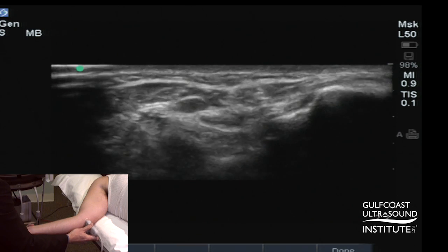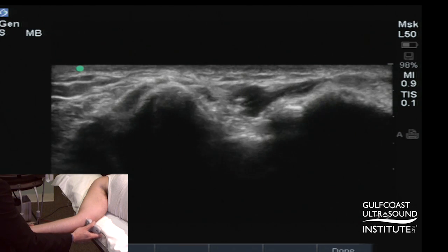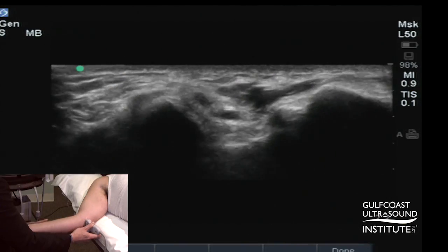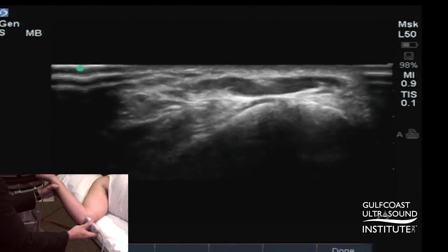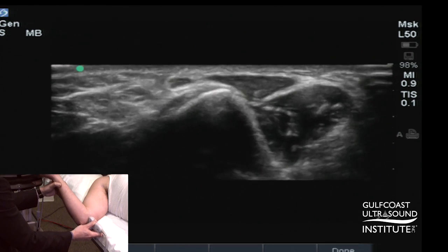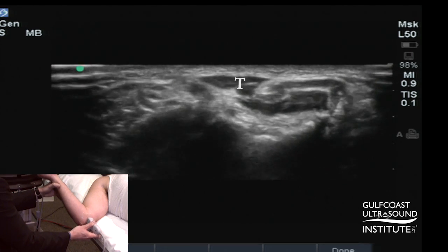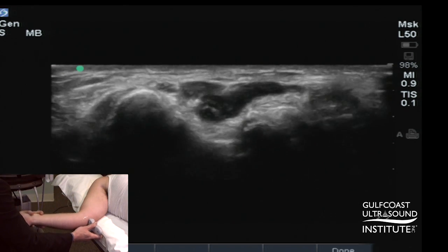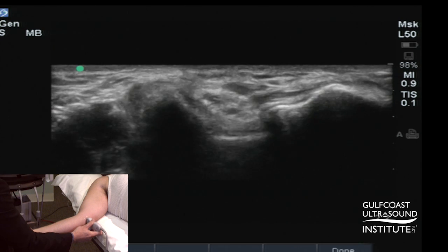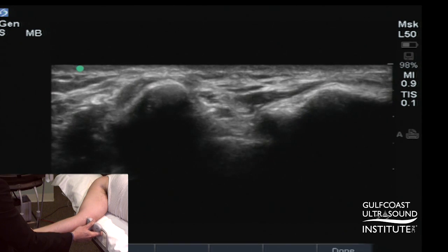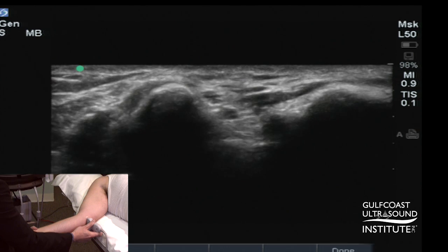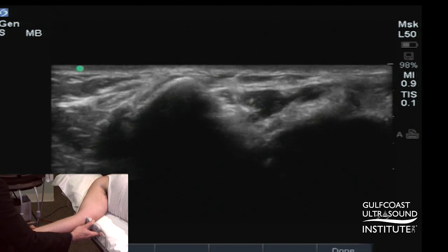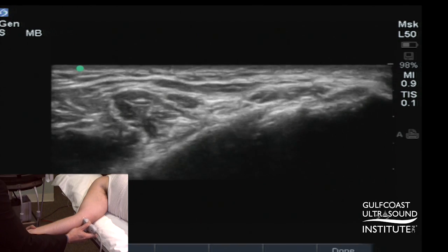Backing up to the medial epicondyle — this is an ideal starting point given the bone landmarks. It's important not to scan with the elbow flexed at this point, because the triceps will be moved into view and diagnosis of an anconeus epitrochlearis will not be possible. However, with the elbow completely extended, there should be nothing in the space between the medial epicondyle and the olecranon process other than the ulnar nerve. We'll look at the nerve proximally and distally in short axis for enlargement as it goes into the cubital tunnel.